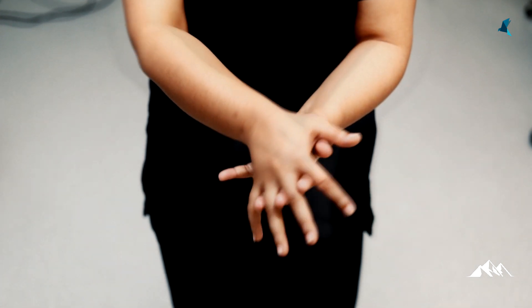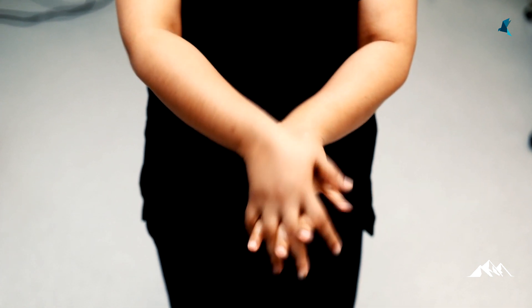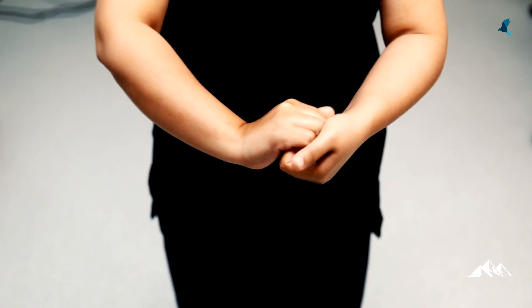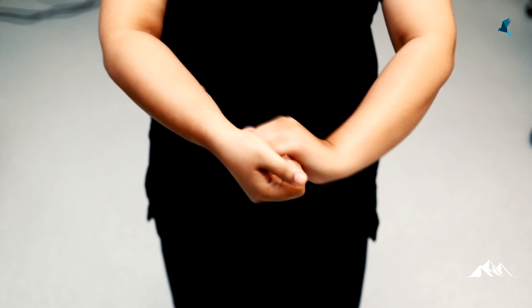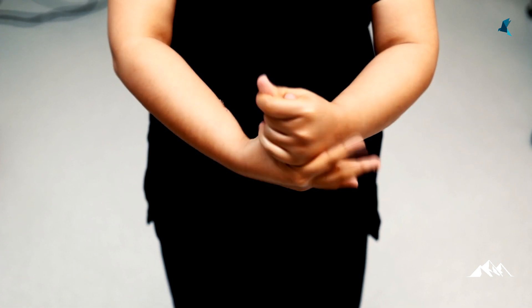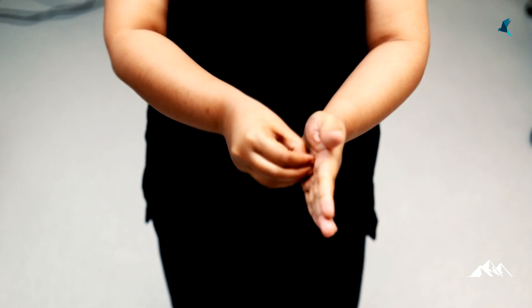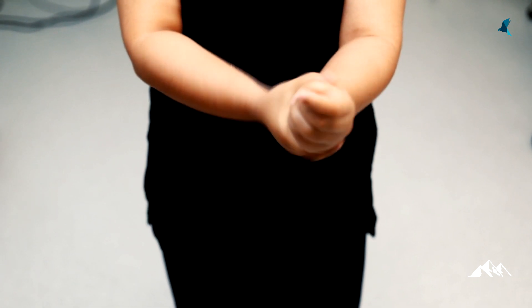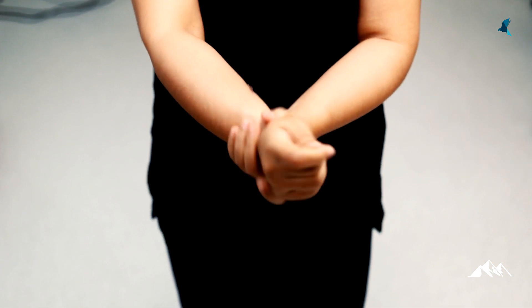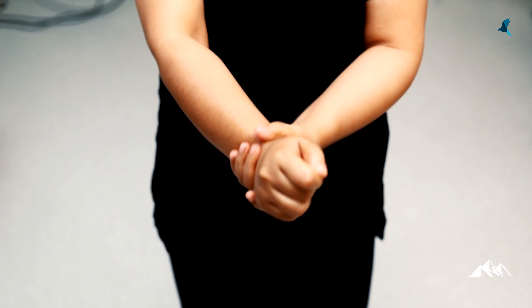Step 1: rub your palms together. Step 2: rub both hands while interlocking the fingers. Step 3: rub the back of each hand — done 5 times for each hand. Step 4: rub the back of your fingers in a locking manner. Step 5: rub your thumbs in rotation. Step 6: rub the tip of your fingers. Step 7: rub the ends of your wrist. After these steps, hands are washed with water. If using an alcohol-based hand rub, by the end of the steps the alcohol solution would have dried off.